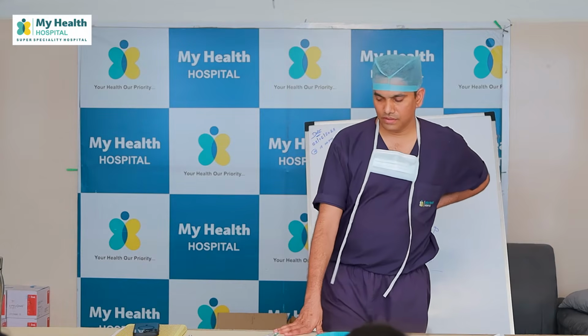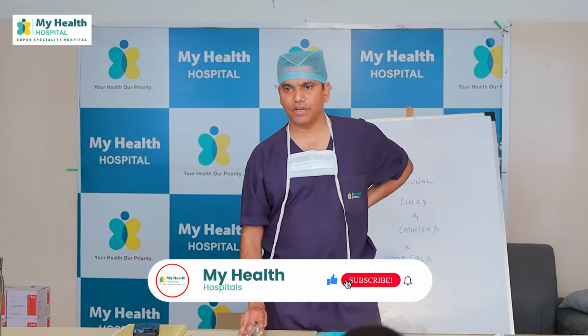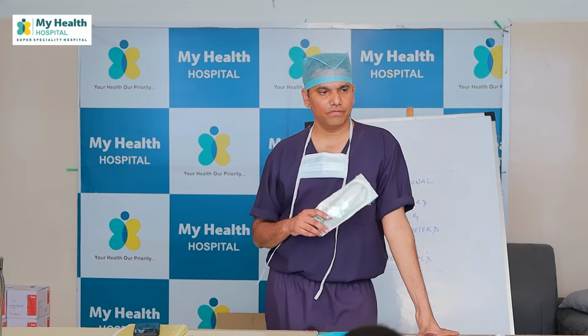Okay, right. I mentioned decompression. In some cases we can use it as a drain. In some cases we can use it for decompression, elective decompression, food poisoning, feeding.